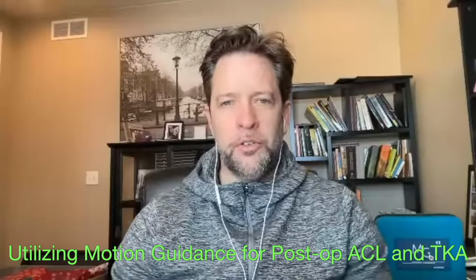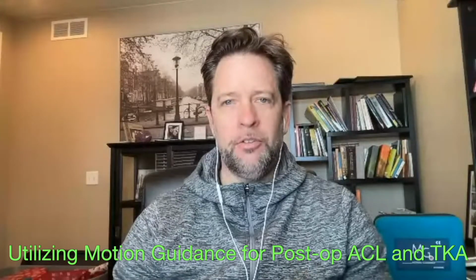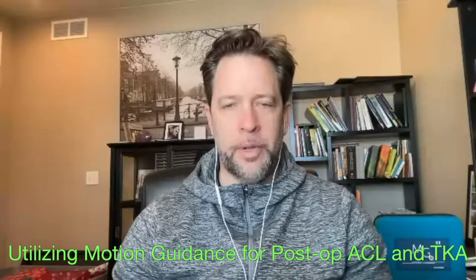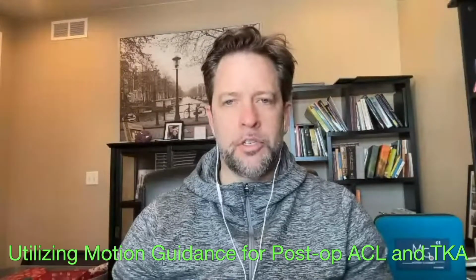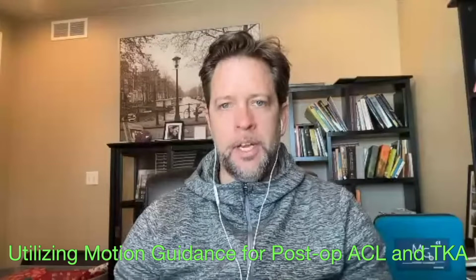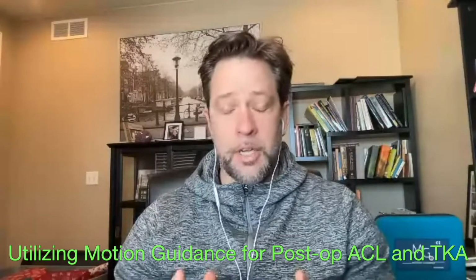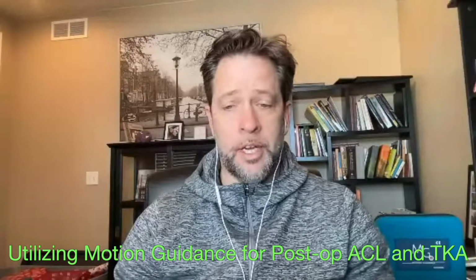We are going to be diving into the topic of how to utilize Motion Guidance for your post-op knee surgical patients. So ACL reconstructions, total knee arthroplasty, anything along that line. I'm excited to bring this content to you because this is a big topic across the whole world. With the aging population that we're seeing here in the United States, we're seeing a lot of joint replacement. With the athletic population, we're seeing a lot of knee injury that can require surgery.